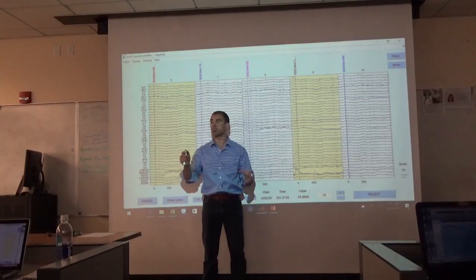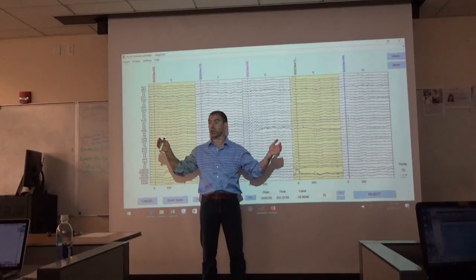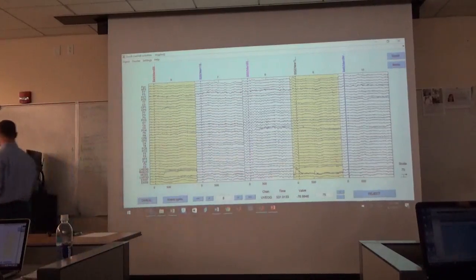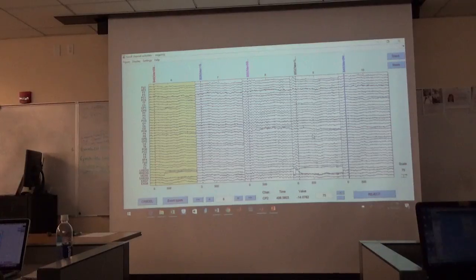Of course, it'll ask you, are you sure you really wanted to reject it? You're going to say yes. But right now, we're going to set up the list of all the stuff we want to reject. Now, just for fun, hit this one again, and it should turn white. It should unselect. So, this is not permanent yet. It will be later. But you can play around with this.